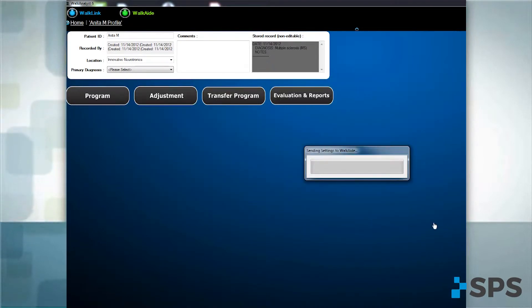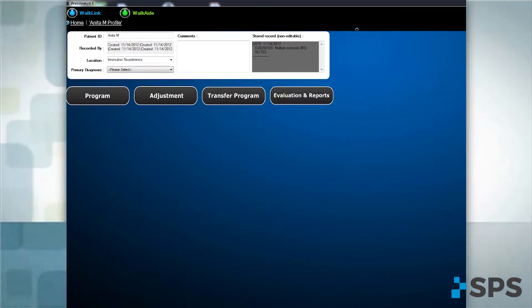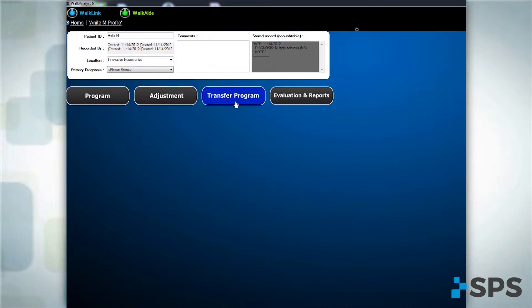This will transfer the program to the WalkAid. If you are transferring a program from the patient's demo unit to their new device, select Transfer Program, then choose Copy a WalkAid.